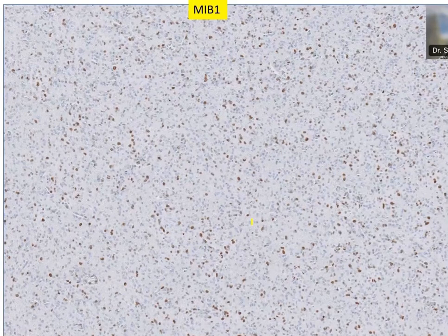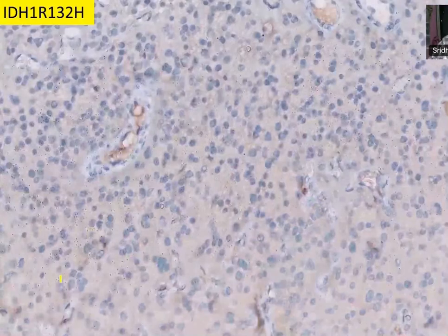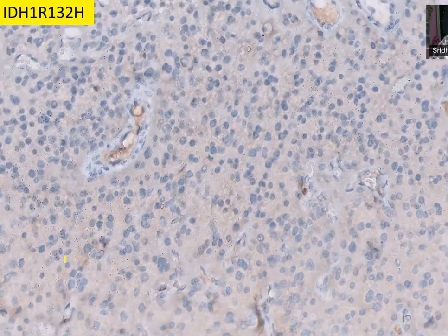So you are saying IDH is negative. Still, you don't know whether you're dealing with a GBM or an IDH mutant. At this point, you could not prove that it's an IDH mutation. You're still having the same higher grade glial tumor. You could not classify whether it's astrocytic or oligo, and IDH you could not confirm. Still, you have a high grade glial adult type tumor, probably because of the 19-year-old. So what is this? It's an ATRX.